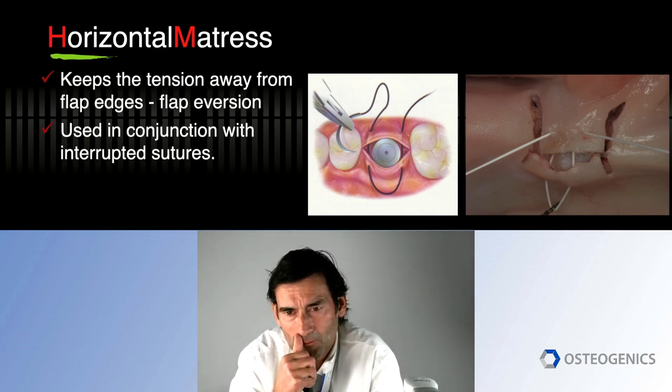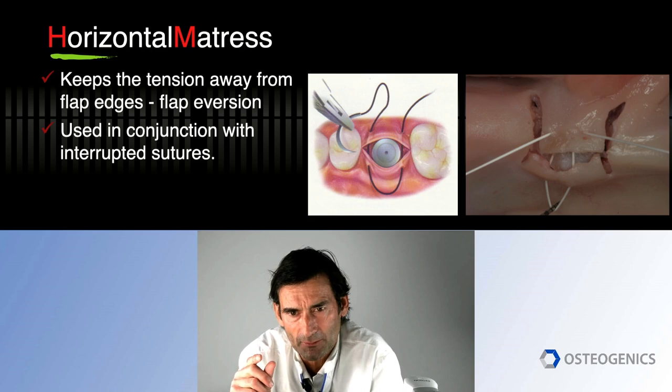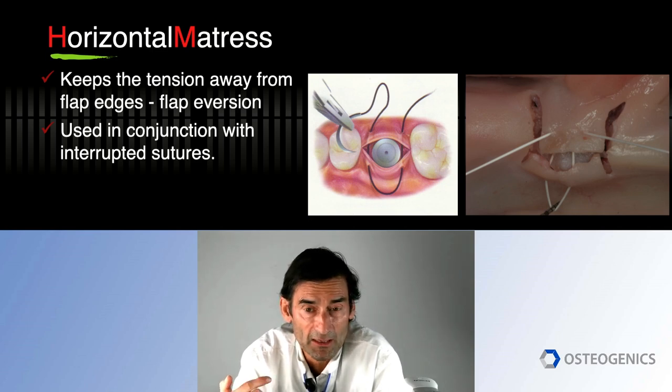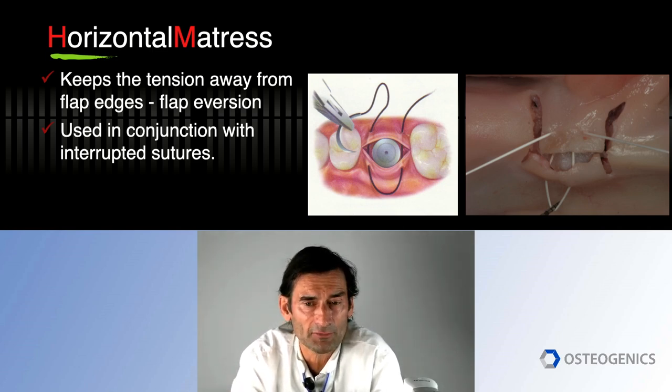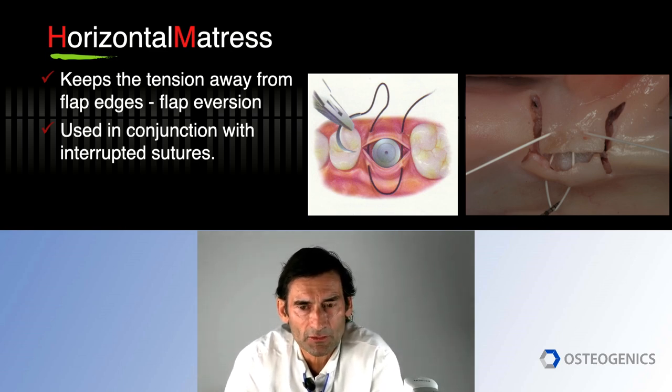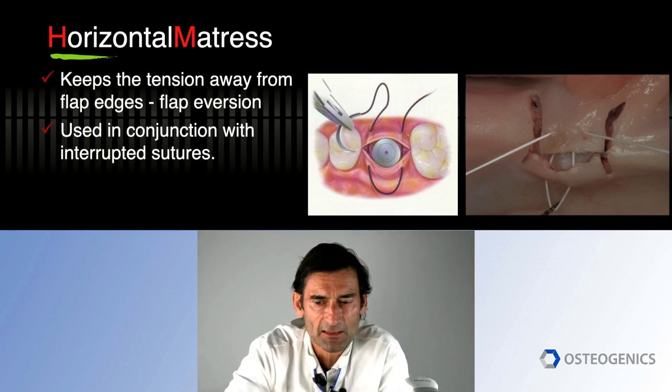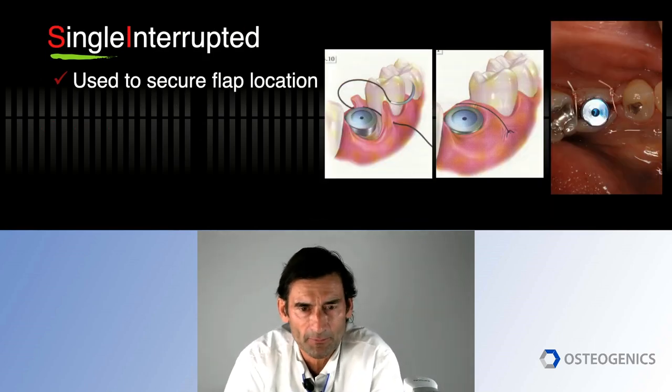Important, of course, is that all the dimensions are similar. So you're looking at entry in the buccal, let's say 3 millimeters from the margin, exit to the lingual or palatal, 3 millimeters. If you're giving a horizontal, go about 3 millimeters and then back in and come through the buccal. So it's really important for us to maintain that optimal width, and keep those distances similar.